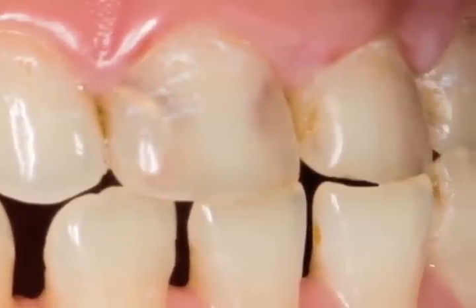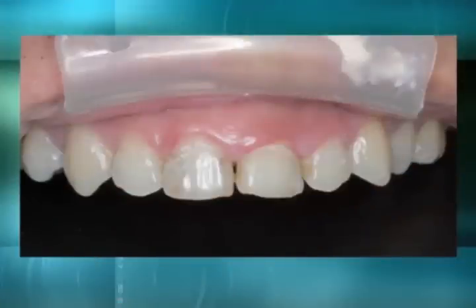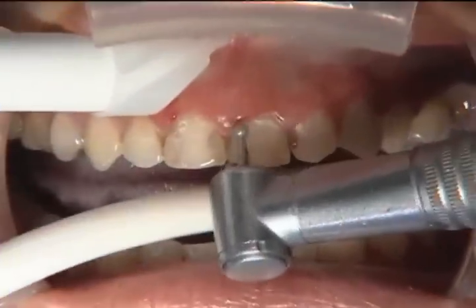We're going to finish off his smile with some no-prep veneers next to the crowns, just to round it off. This has been one of the really neat things about no-prep veneers that I didn't anticipate — the ability to finish off a smile without having to do any additional preparation.